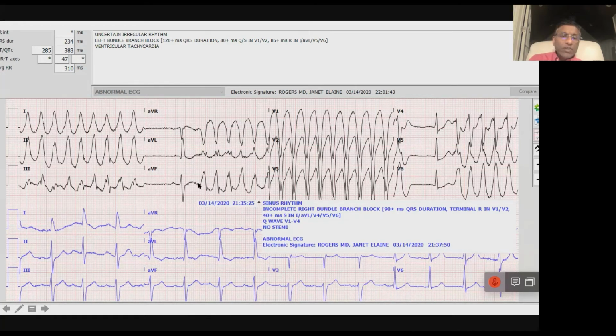So I come down here and then I follow and I say, okay, QRS actually starts way over here. So then I know this is a slower downstroke in AVR and not as sharp. So more suggestive of VT than SVT. And apparently whoever was reading got this right as well.